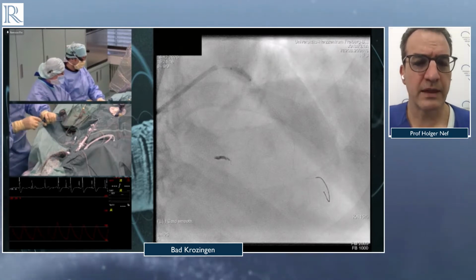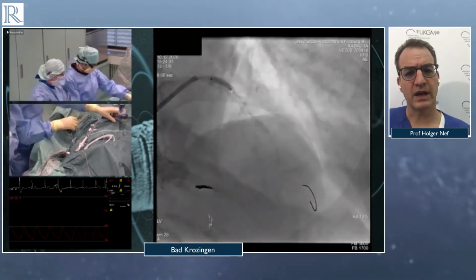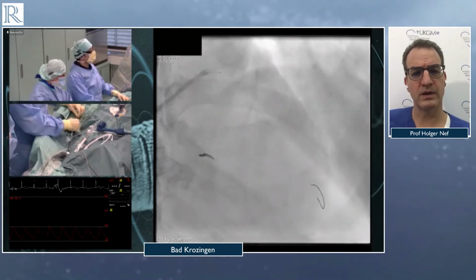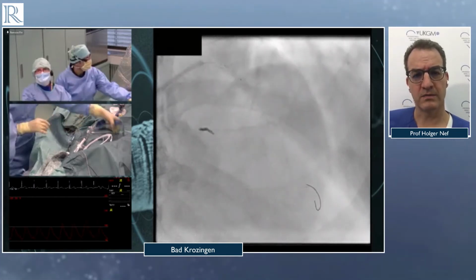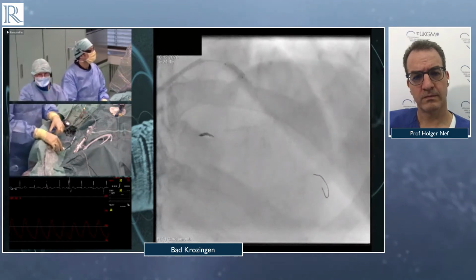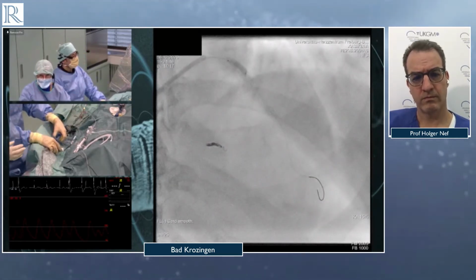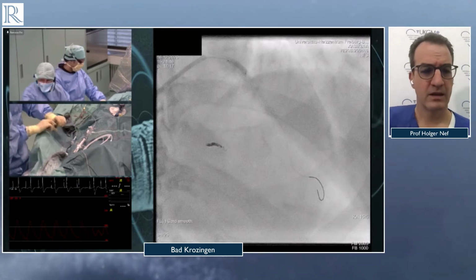Regarding the size of the IVL balloon, do you go for a 1:1 balloon-artery ratio? As I mentioned before, balloon size should be in a 1:1 ratio. So for a 3.5 vessel, you should take a 3.5 Shockwave balloon, and this is what we just did.